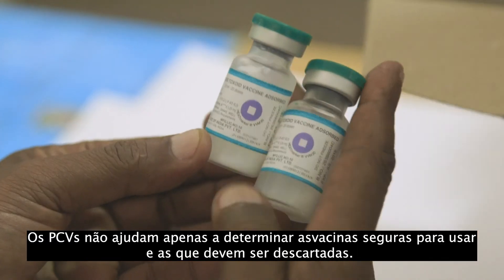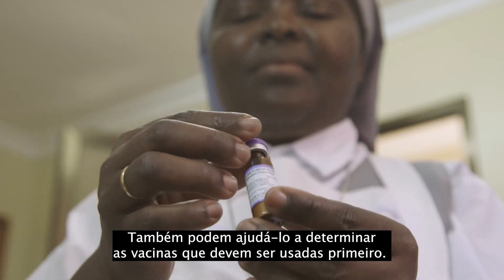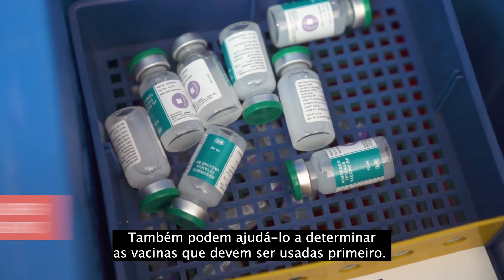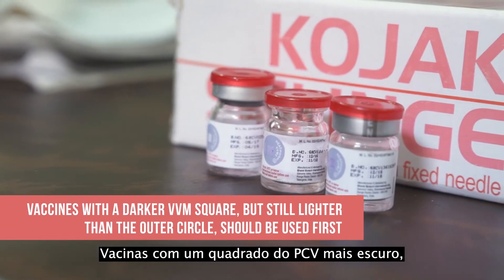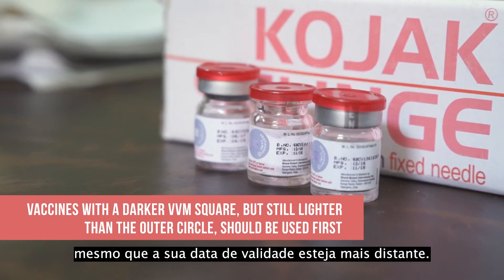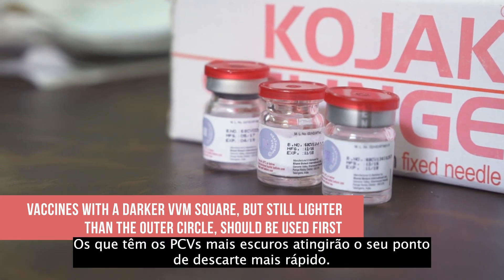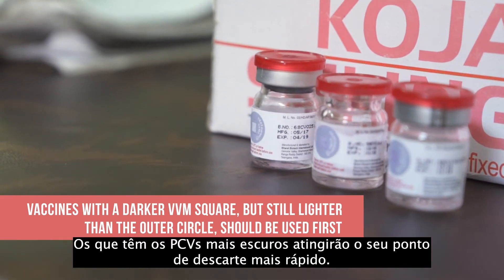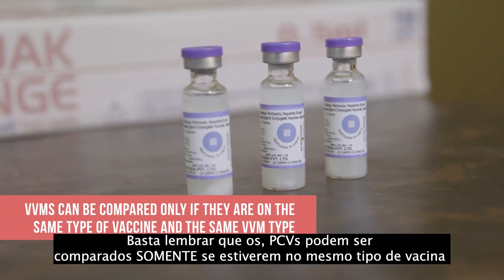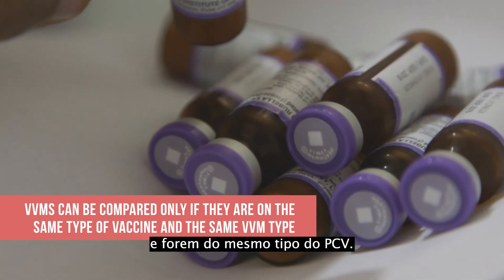VVMs do not just help determine which vaccines are safe to use and which ones should be discarded. They can also help you determine which vaccines should be used first. Vaccines with a darker VVM square, but still lighter than the outer circle, should be used first, even if the expiry date is further away. The ones with the darker VVMs will reach their discard point fastest. Just remember, VVMs can be compared only if they are on the same type of vaccine and are the same VVM type.